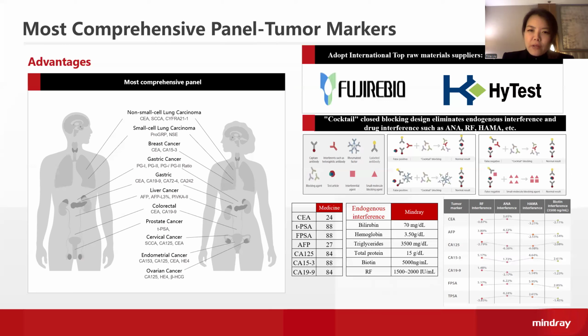There are 22 regular and special markers in the tumor marker panel. They can aid in diagnosis and monitoring of many highly prevalent cancers in men and women. Although serological testing cannot replace the clinical practice of histology and imaging, as they are non-invasive and easy to use, they are widely applied to assist diagnosis, treatment monitoring, and prognosis.